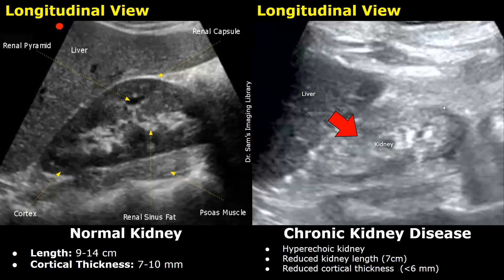Overall, the kidney appears very hyperechoic and heterogeneous, measuring around 7 centimeters in length. The normal length is between 9 and 14 centimeters, and the normal cortical thickness is between 7 and 10 millimeters. In chronic kidney disease, the cortical thickness may be less than 6 millimeters.